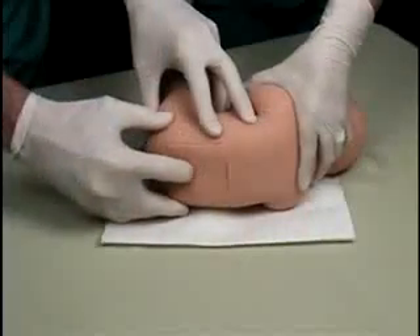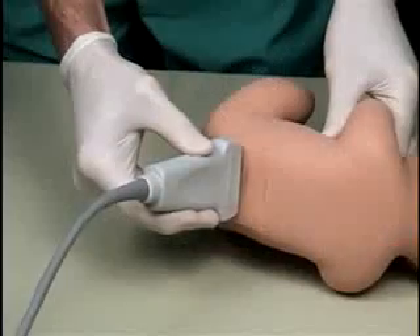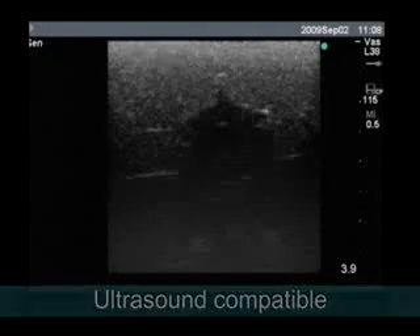This trainer's replaceable tissues are durable for multiple uses, and they are self-sealing, so repeated procedures will only leave minor needle marks over time when viewed under ultrasound.